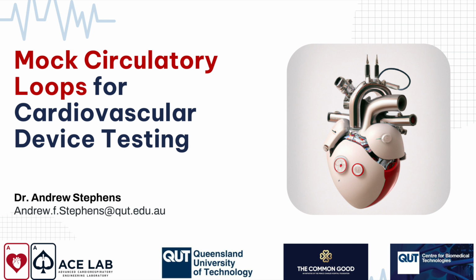Here, and this is how we do it, we have a pneumatic line with a pinch valve where the pressure in this system, as it builds up, causes more restriction, and we can use a simple controller to control the amount of resistance we want to impose on the circuit based on the pressure and flow.